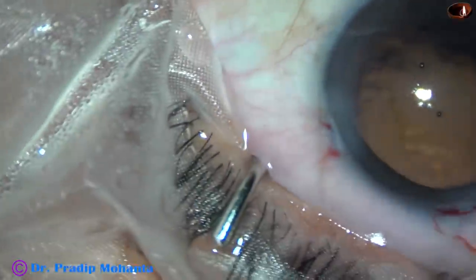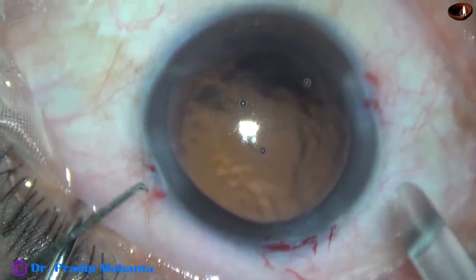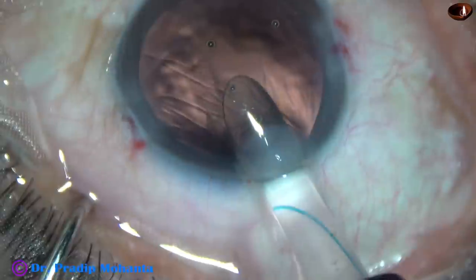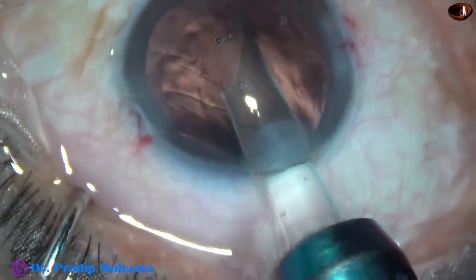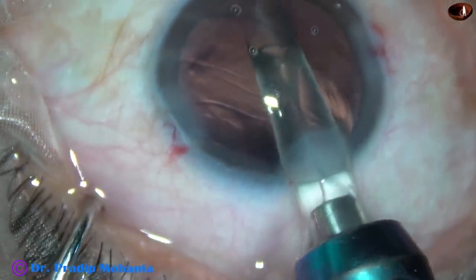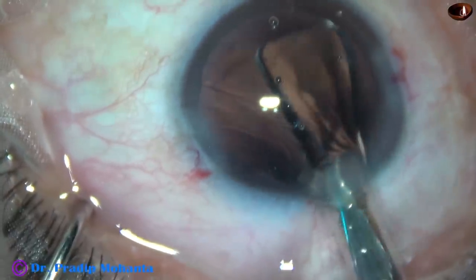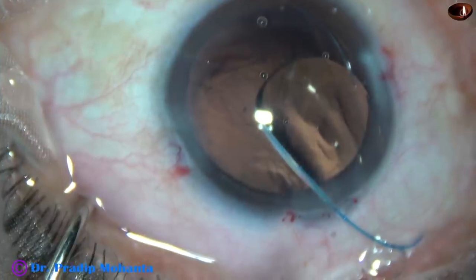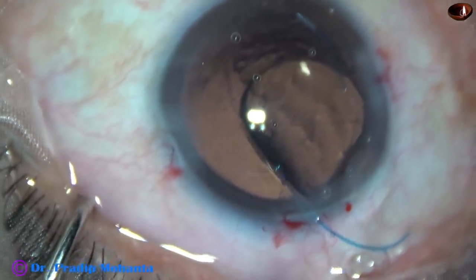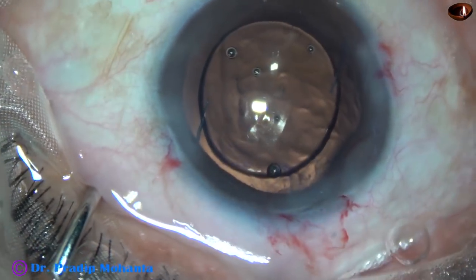Now here the lens has been loaded in the cartridge and the cartridge is rotated clockwise so that the haptic goes into the sulcus. We can place the haptics over the anterior capsule — anterior capsular rim inferiorly. So I placed the lens directly into the sulcus and now hold the trailing haptic with forceps and place the trailing haptic in the sulcus. Now the lens is rotated a bit; the haptics are at three o'clock, and now I remove the viscoelastic from the anterior chamber from the aspect of the intraocular lens by this Simcoe cannula.